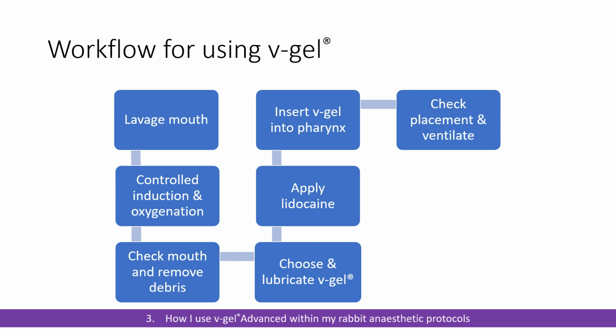Generally, with most of our pet rabbits, you want the smallest rebreathing bag that's available, 250 ml rebreathing bag, nothing more than that. These animals have a tidal volume of around 6 to 8 mls per kilo, so taking a 1 litre bag and squeezing it hard is a recipe for disaster. So smallest bag that you have available and just squeeze gently.